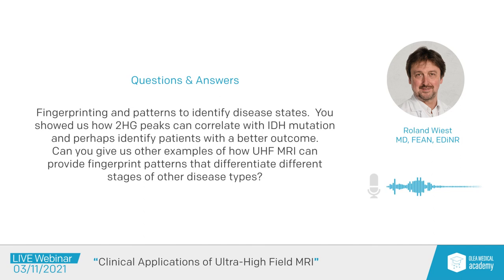And one of the very simple examples that I do have is that we looked systematically at the surface to volume ratio. That's a very simple marker. So instead of calculating the volume of hippocampal atrophy, you combine the volume with the surface ratio. And this turned out to have a much higher effect size once you combine these two parameters compared to when you just look at the simple segmentation and take out the volume. So this is one of the really simple ones.